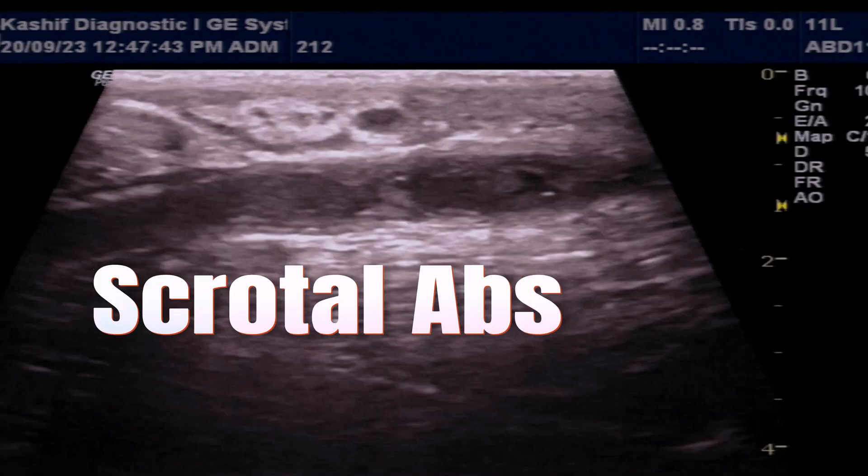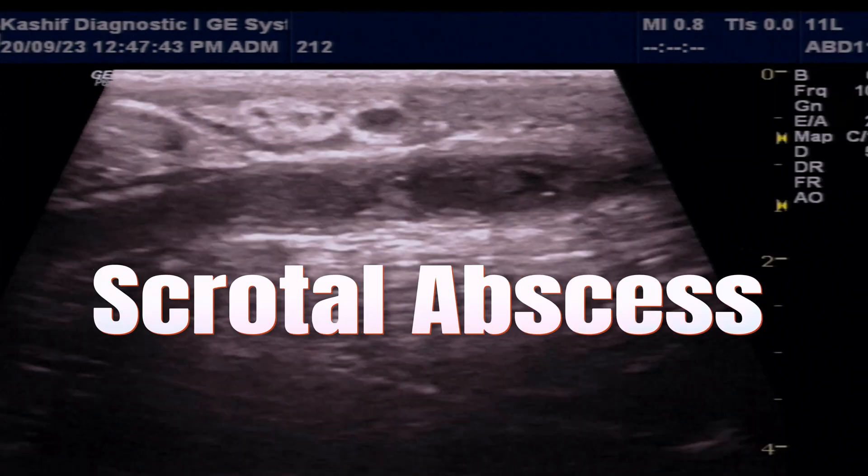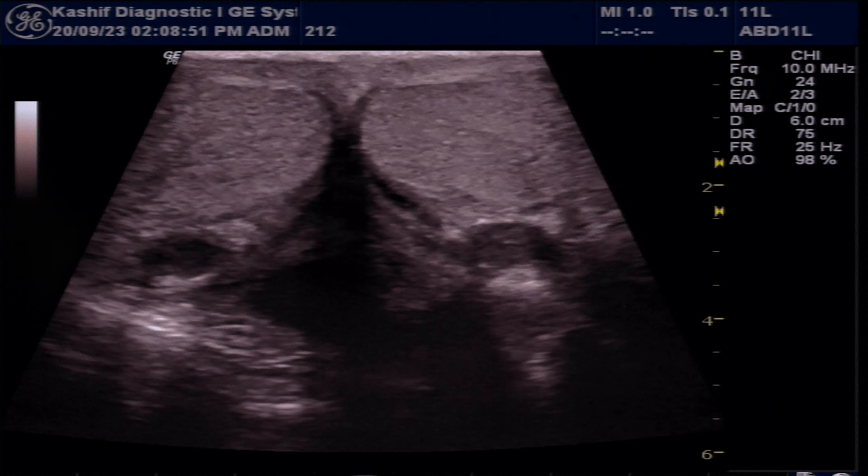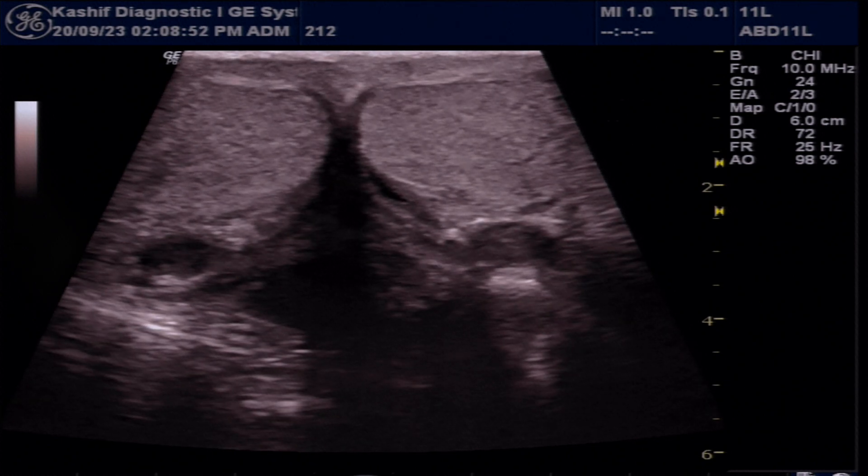This is a case of scrotal abscess, a severe complication of epididymitis.